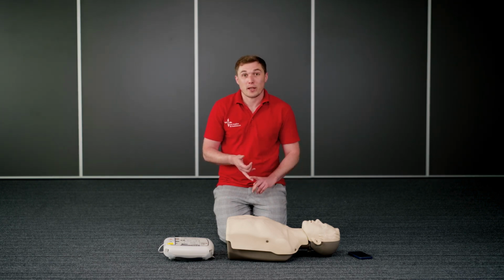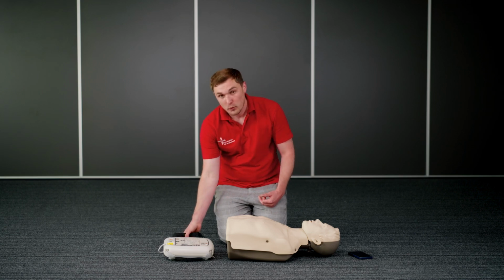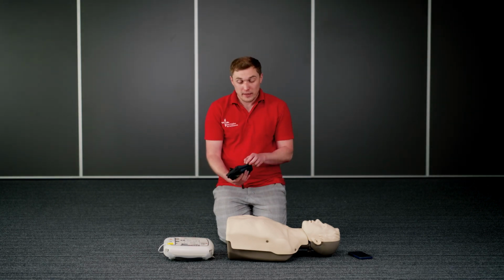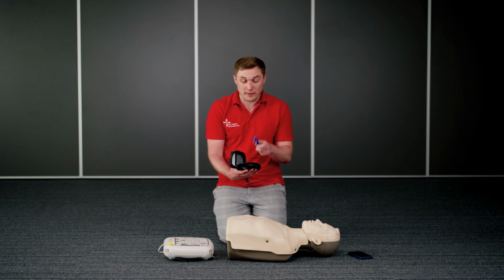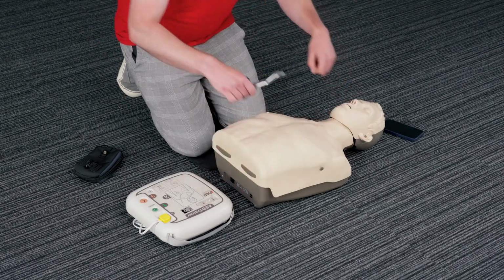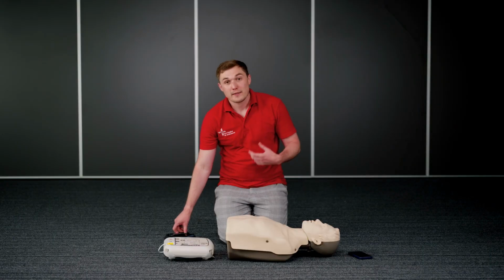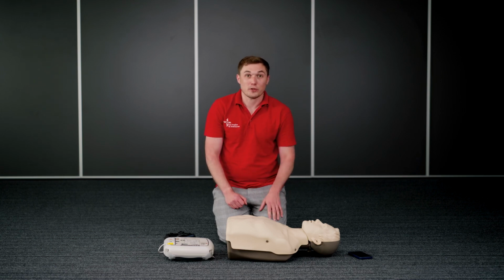The next step it will say is to prep the chest, exposing the chest as much as possible. They will come with a chest prep kit. These come with, as a minimum, a pair of tough cut scissors, a surgical razor, and a cloth of some sort. I'll use the scissors to cut at the side of the clothing, pulling that clothing out of the way. It will then tell me to take the pads out of their packaging and to place them onto the chest.